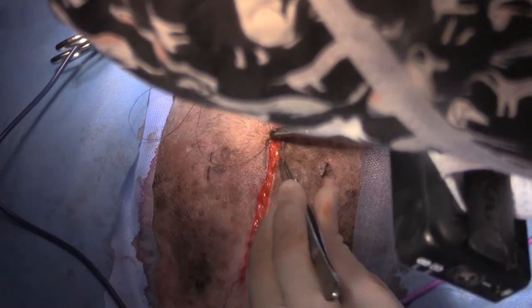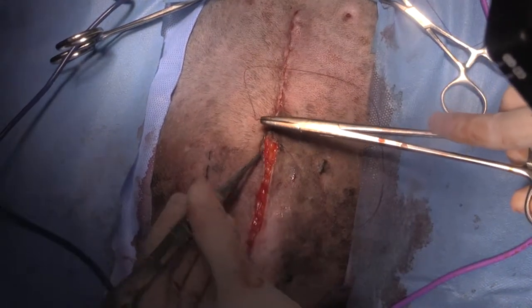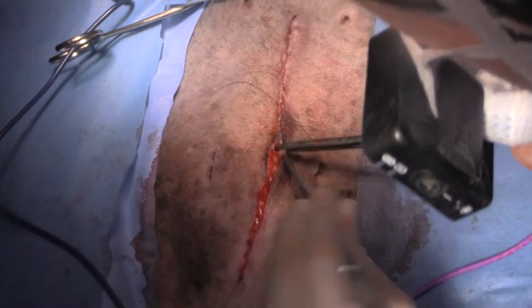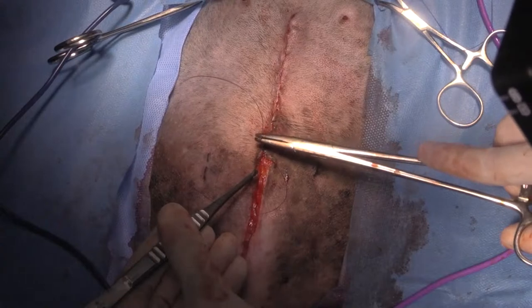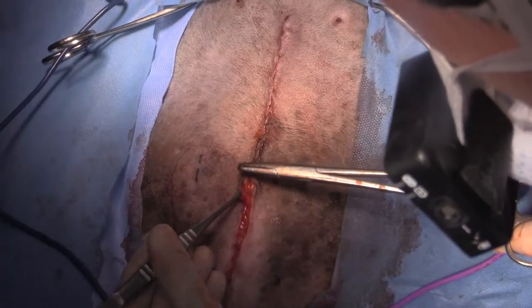There's always a little bit of annoyance around the umbilicus. The skin there tends to be a bit more lax and sloppy, so to speak. That means when you are doing an intradermal layer, it's slightly trickier to get that complete apposition and get your needle through properly, especially when, like we always do, we're using a tapered needle that we've already run along the subcutaneous layer, so it can get slightly blunted. The sharp needle does work best in really getting through those tissues nicely, but still coming together fairly well.